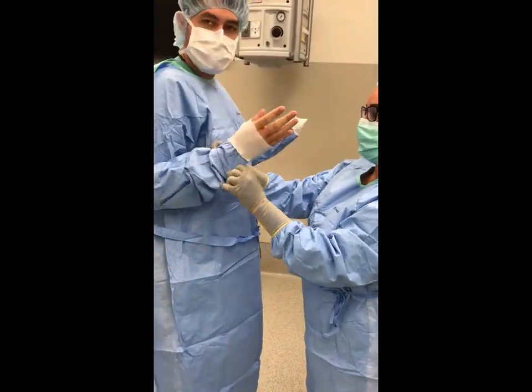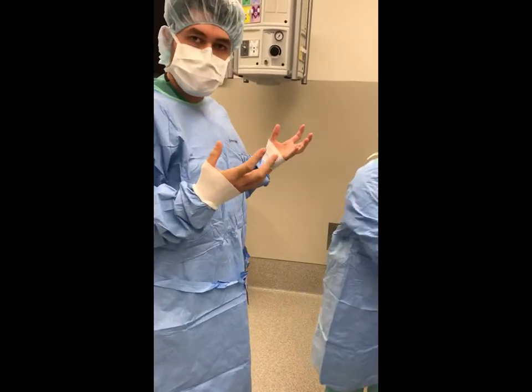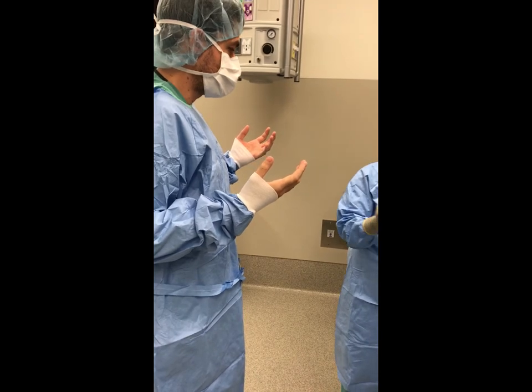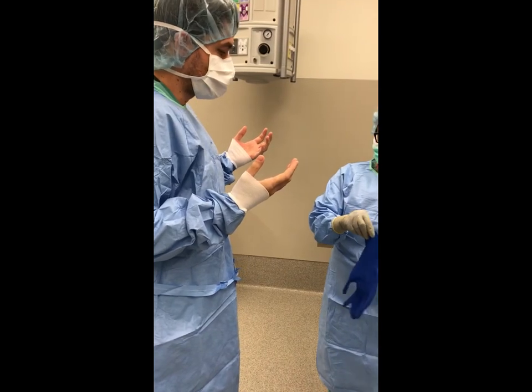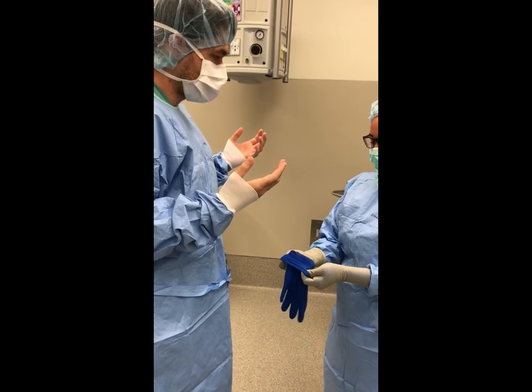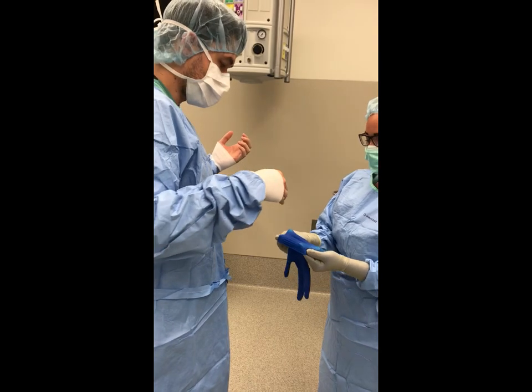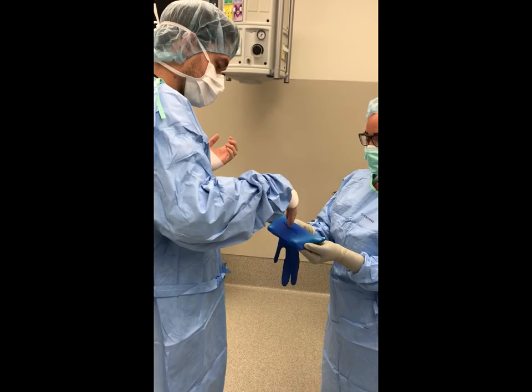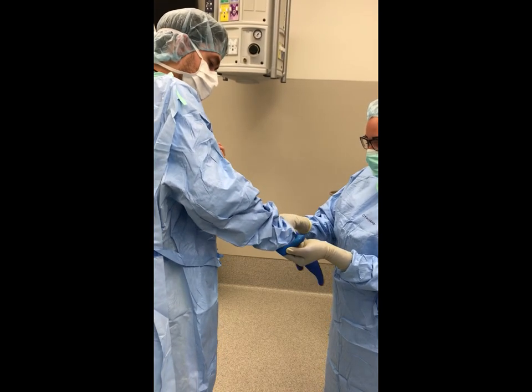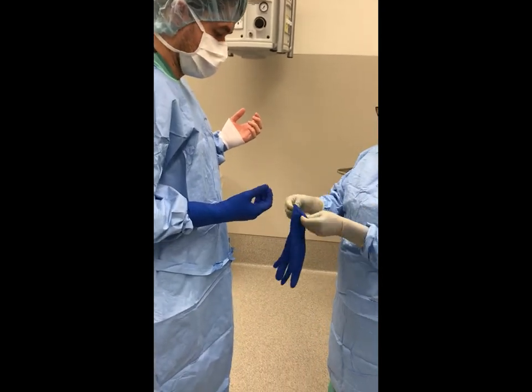A gowned and gloved individual may also assist another gowned individual with gloving. To assist, grab the glove under the cuff, ensuring the palm of the glove is turned towards the ungloved individual's hand with the thumb of the glove directly opposed to the thumb of the individual's hand. Using the fingers, stretch the cuff to open the glove so the ungloved individual can insert their hand. Repeat the procedure for the other hand.